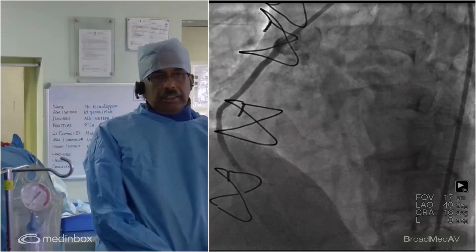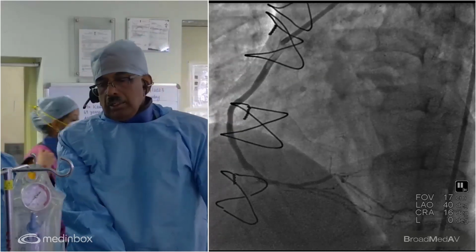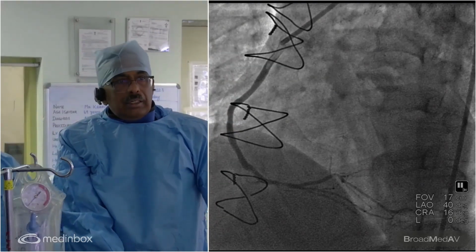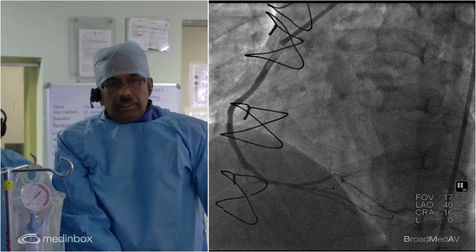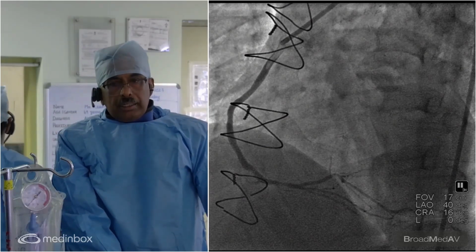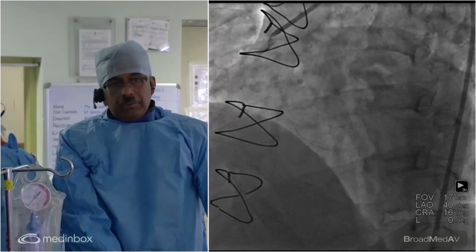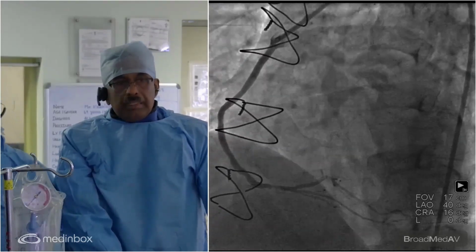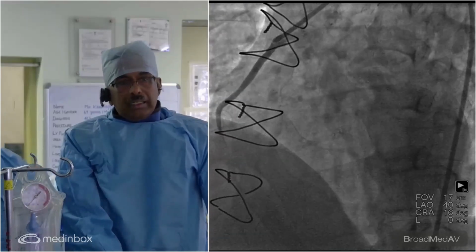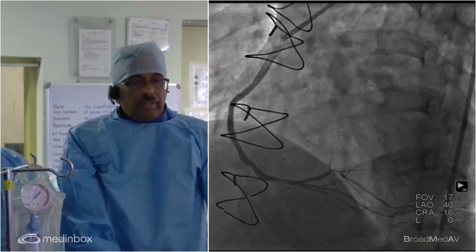So we will not be able to get a good picture since the OCT catheter doesn't have the length. Now the next question, in a vein graft, is: do we need to protect these grafts? In 2005, due to a large randomized trial with one of the wires, the GuardWire, we had data to suggest that all patients should be protected during a vein graft intervention due to reduced 30-day MACE outcomes. And this was the basis of a class 1A guideline for protection.